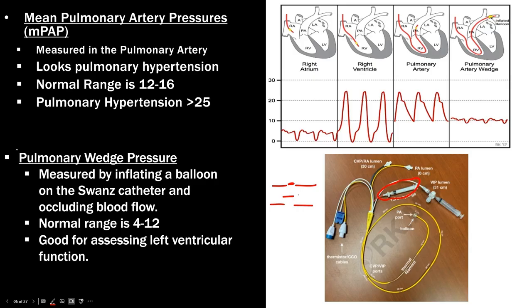So just always make sure that you have this offset of red lines on the syringe so that you don't accidentally wedge your patient while you're moving them up in the bed or if they turn or something like that. Because that would be less than good. You can only wedge your patients for about 6 seconds before you start having issues.